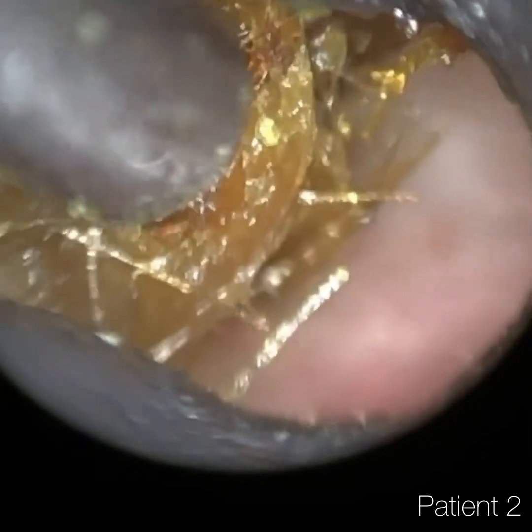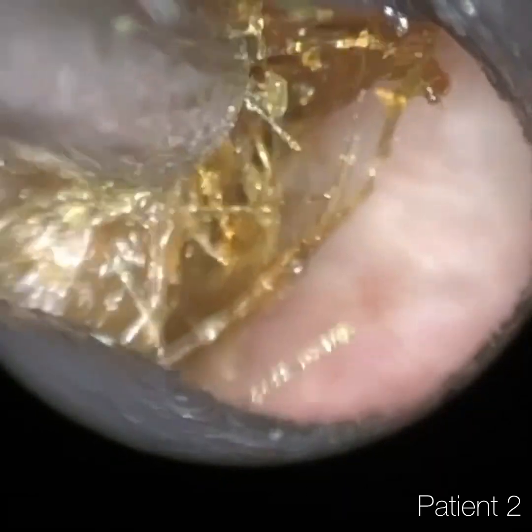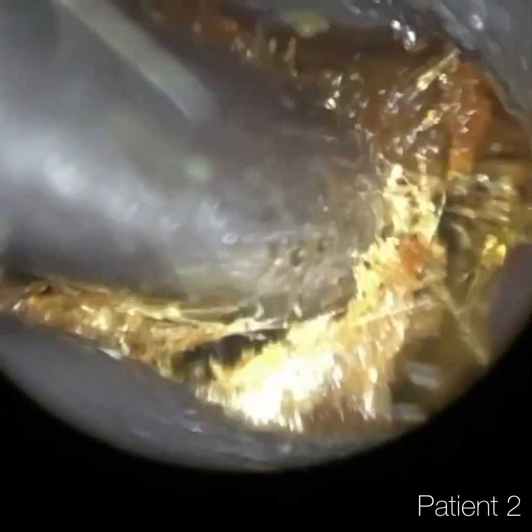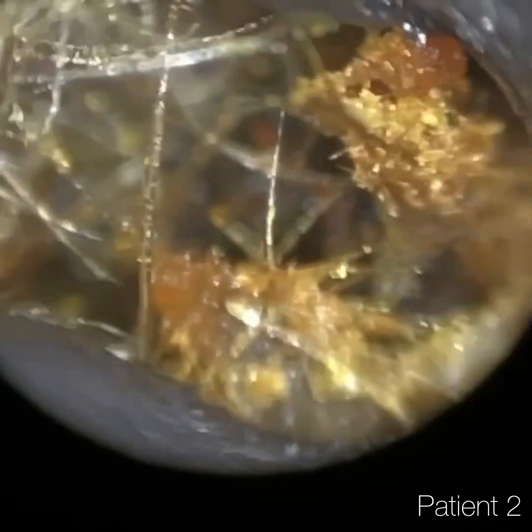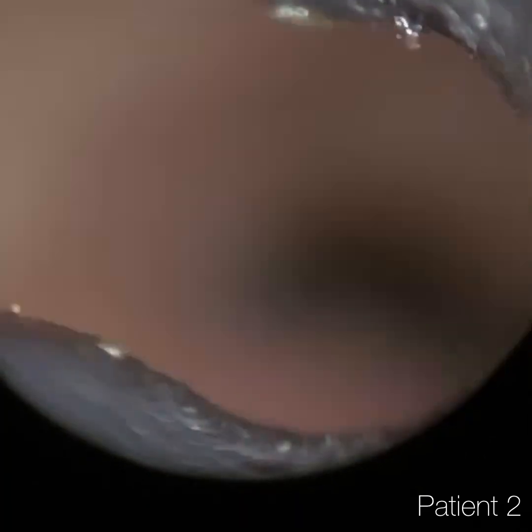Slowly but surely, we're just separating this wax from the canal wall. I actually use an ENT microscope at the clinic, and I used that the other day as well. In terms of the clarity of view, I think the Waxscope — at least compared to my ENT microscope — really stood firmly against it. It was quite amazing, actually.